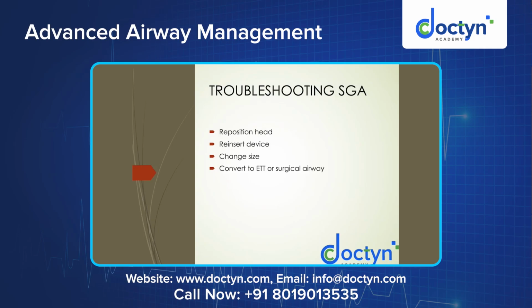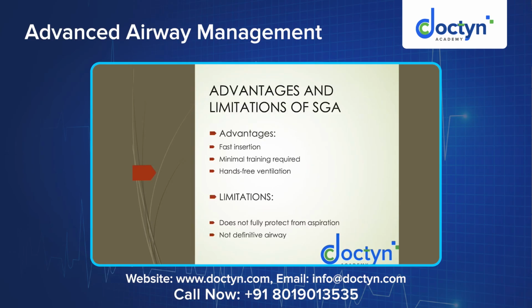So how do you troubleshoot all this? First you reposition the head, you check that the head is not in a different position. Even then, if it is not improving the saturation or the ventilation is not being delivered adequately, you reinsert the device. You remove the device and reinsert it, readjusting its position. You change the size, upsize or downsize the supraglottic airway device. Else, if all these three also fail, then you convert to endotracheal intubation, a definitive airway, or a surgical airway.